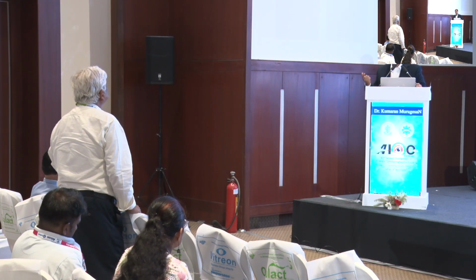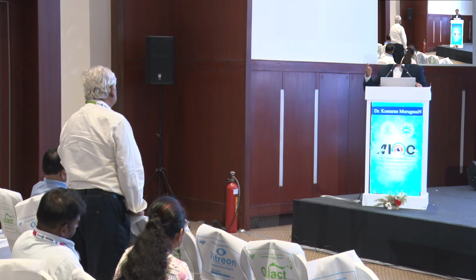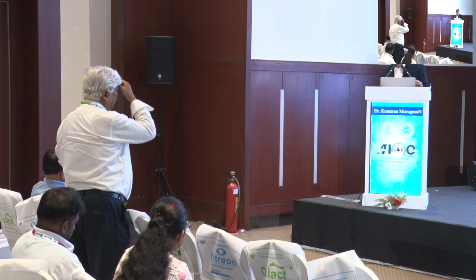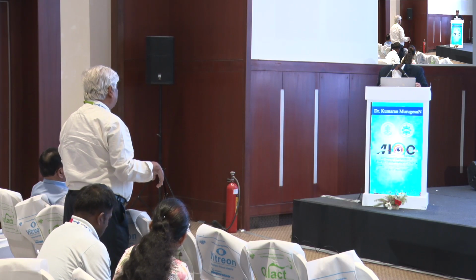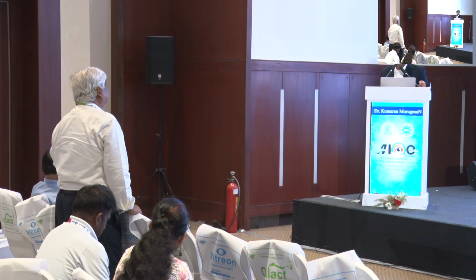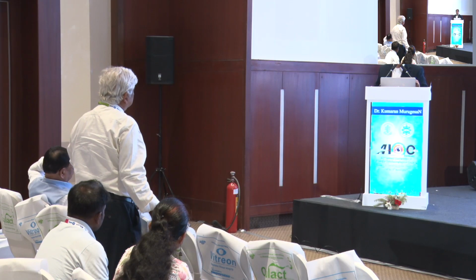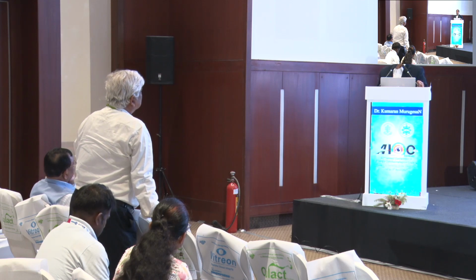You have 400 square feet of operation theatre, you have to put so many lamps around to make sure that your operating table has the correct intensity. So this is the reason why a UV light would not work. Is there any mathematical calculation, say for a 400 square meter operation theatre, how many UV lamps have to be fitted? So you will have a biomedical engineer who would calculate these things for you. But it will not be practically possible to put so many lights into the room.